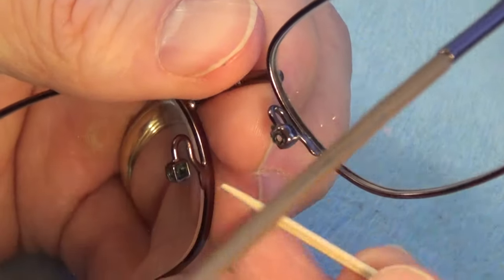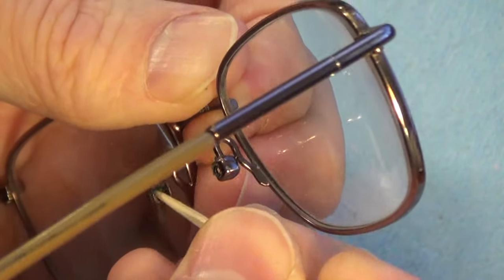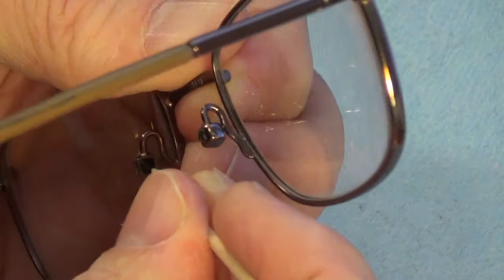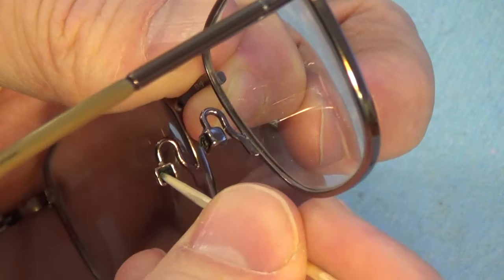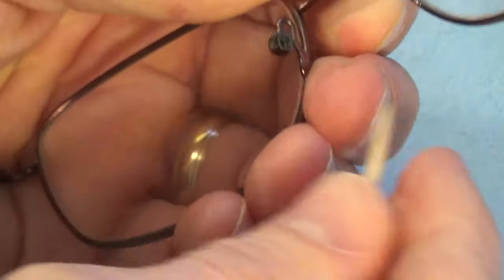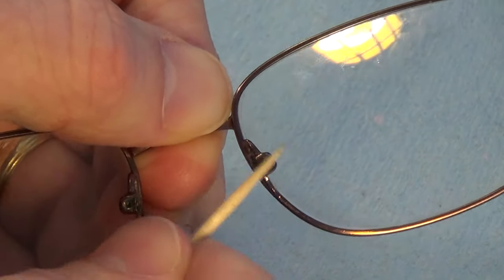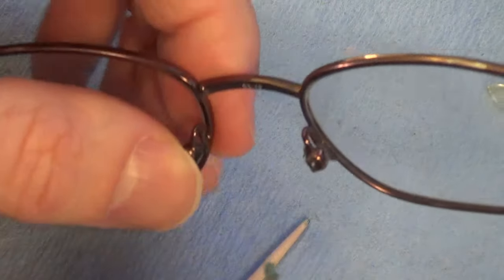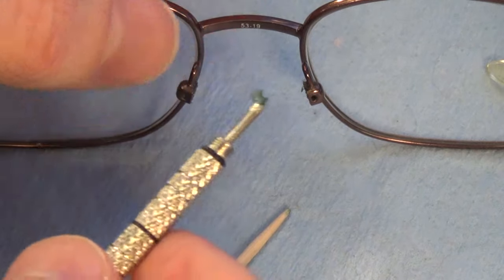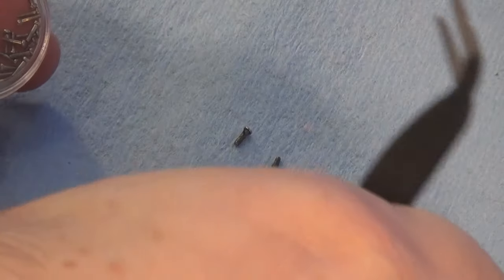On the side where the pad broke off, there may be a little piece still lodged in the hole. I'm using a toothpick to probe and clean it out. I didn't feel anything at first, but when I cleaned the holes with a little isopropyl alcohol, I actually did find a small broken piece stuck inside. You can see the tip of it — I had to dig it out. It's worth cleaning these holes since oils and debris can accumulate.